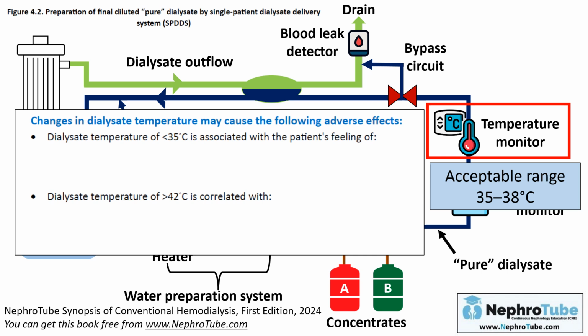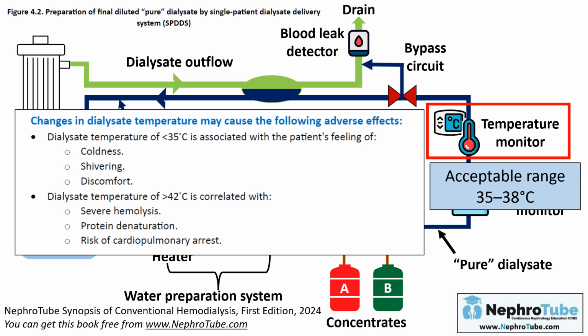With a low temperature dialysate, the patient may feel cold, and there may be shivering and discomfort. And with high temperature dialysate, this is very harmful. It may cause severe hemolysis, protein denaturation, and may cause cardiopulmonary arrest.